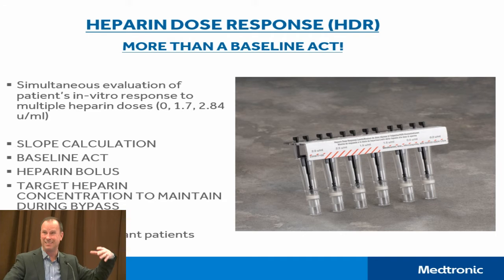So the reason why I say this is there are point of care institutions that will pressure you to give up the HMS in its entirety, or at least this particular test, because their claim is there's no QC for it. Well, I'm happy to handle those people, because for them, we've got a set policy of handling that particular requirement. They just may not know about it. It may not be in their SOPs of regulating this instrument because they could be old.